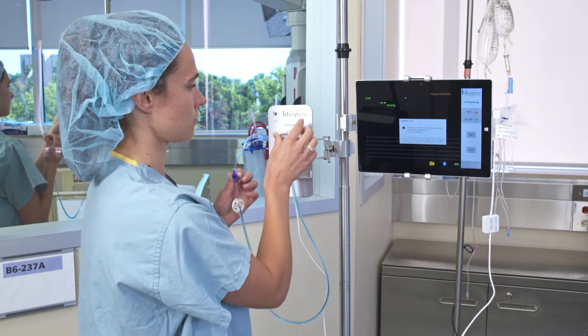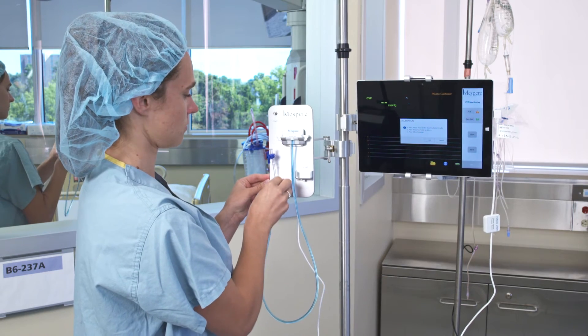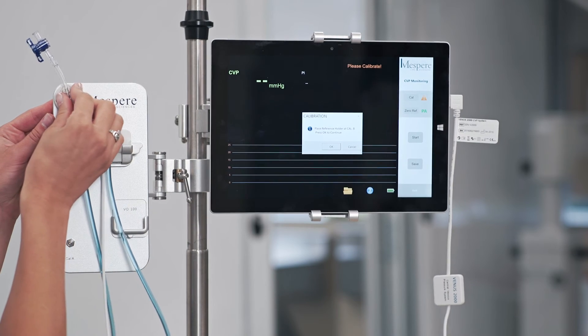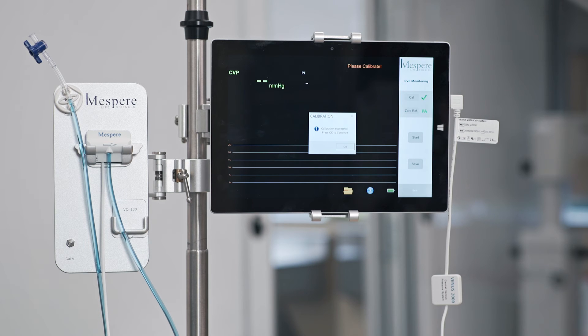Place the sensor head into the cradle on the docking station. Attach the reference holder to Cal A and press OK. Move the reference holder from Cal A to Cal B and press OK. The message on the screen will indicate a successful calibration.